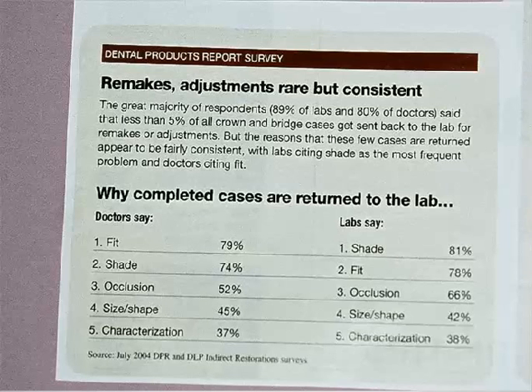But the key to it is also the outcome. You take a radiograph, you can see the fine margination that's created with these restorations. The opaque layer is the cementing layer, and the radiolucent area is the ceramic material. But by putting all these facets and features together, we can offer this time and time again to our patients. And that's really what we're going to deal with tonight, is how we can achieve this type of outcome.